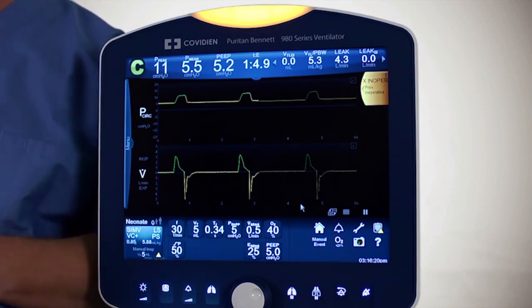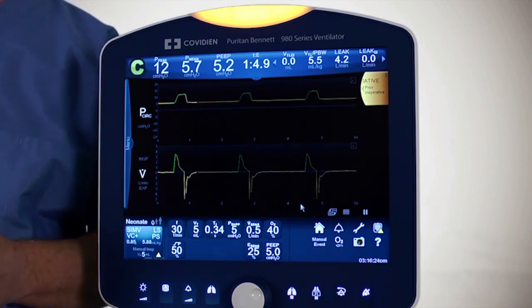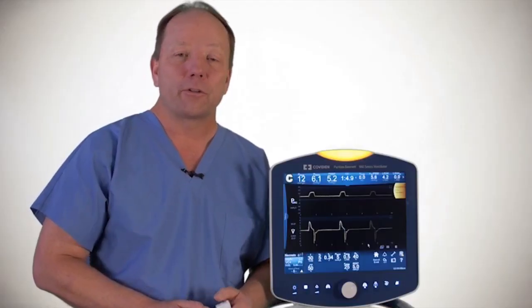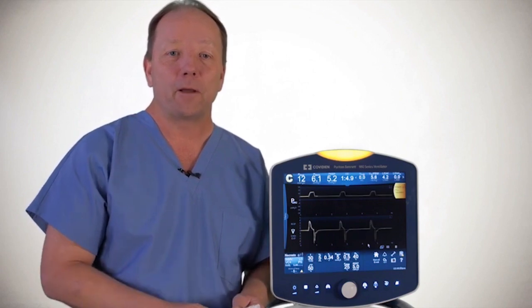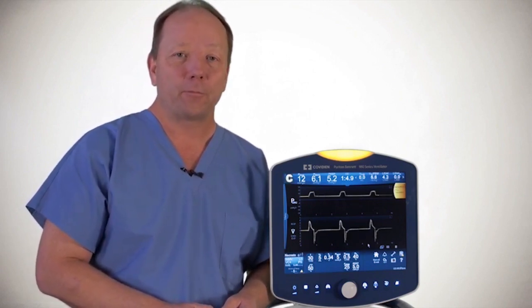The ProxFlow sensor can be a nice addition to improving the graphics displays and giving you real-time measurements at the patient Y, as well as other pieces of information that might be helpful in managing the patient. For further information, please consult the Operator's Manual.